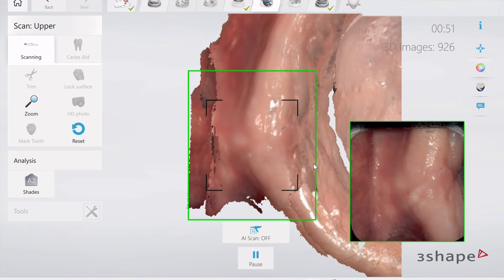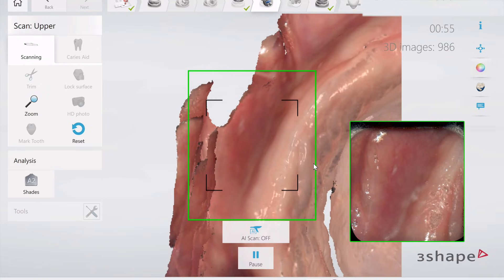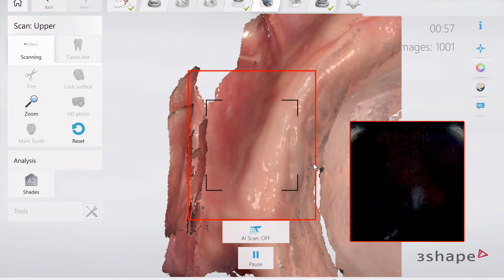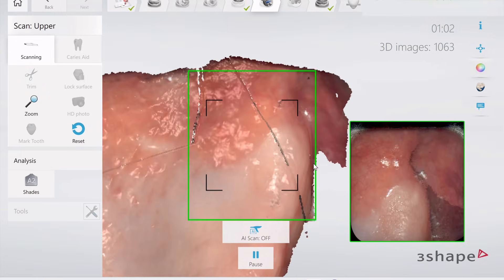Something that I think is really important to note is that if you are designing on an intraoral scan, you need to adjust your design parameters appropriately to have border retention. We typically go back and add a little bit of pressure to those areas.